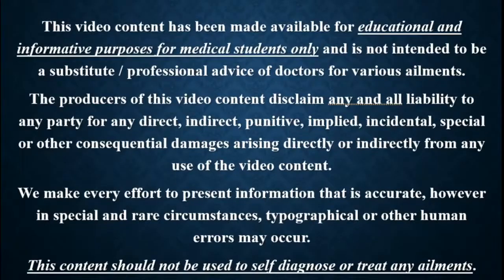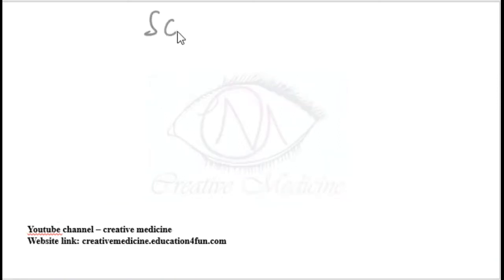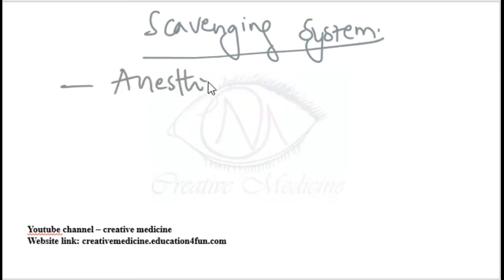In this lecture, we will learn about the scavenging system. Scavenging system will eliminate the excessive gases from the operation theater. Anesthetic gases will result in ozone depletion. So to prevent that, we have the scavenging system.